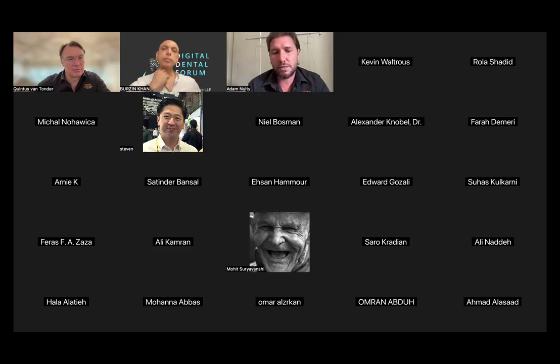And so that's to me where 3D printing comes in to really help us if we're doing all of these things, because that's what it's there for, as a full prototype verification. And this kind of answers the question someone's asked about a verification jig. Do I do a verification jig? And the answer is always, but I'm not doing it for ScanLadder. If you use ScanLadder in the correct way and you position them in the correct way and you get a good scan, if you control your field, it will work.